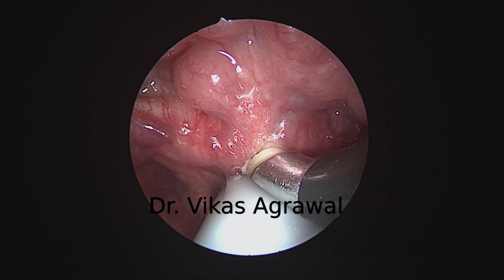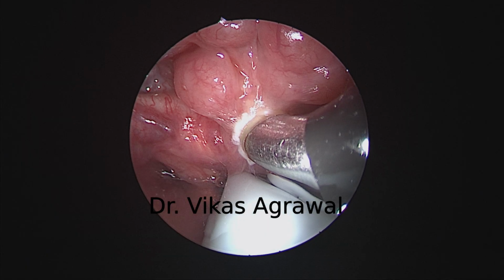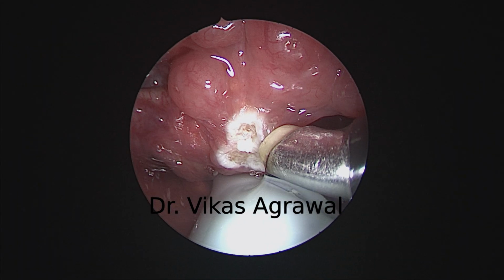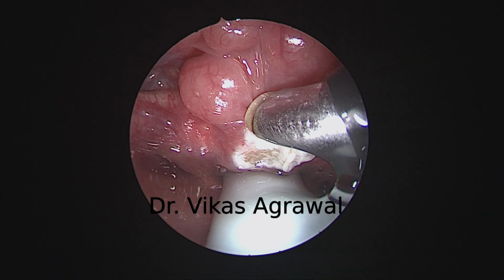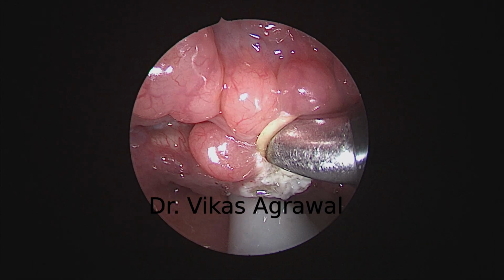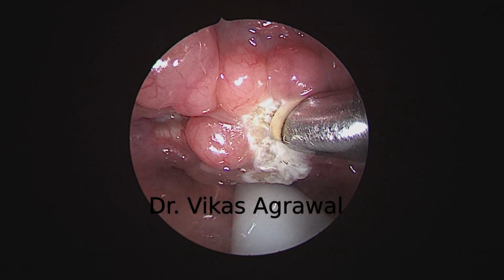And I'm only coagulating. I'm not ablating. I'm coagulating with the coblation wand at a setting of 4 for coagulation. I'm right in the midline. This patient is unable to tolerate CPAP. This is the median glossoepiglottic ligament. I'm coagulating the whole ligament.